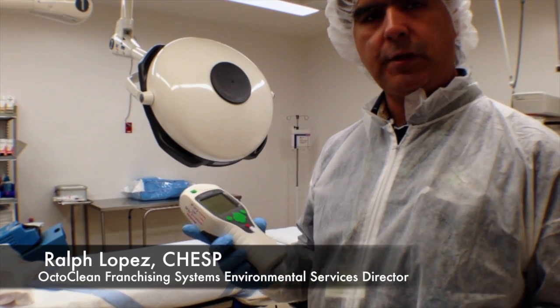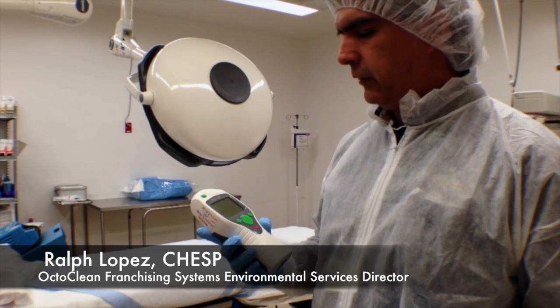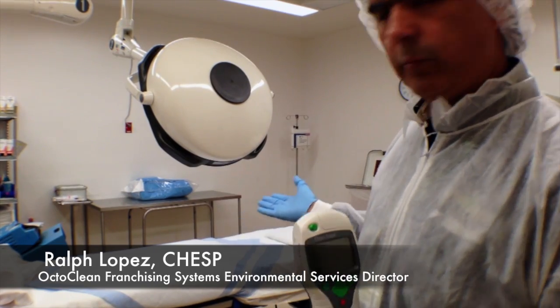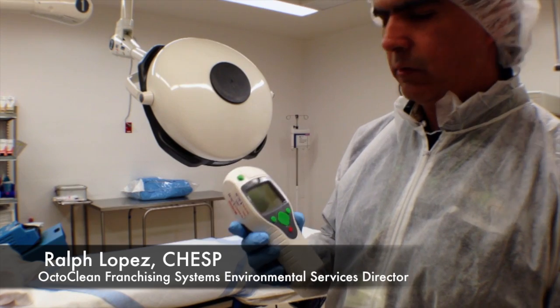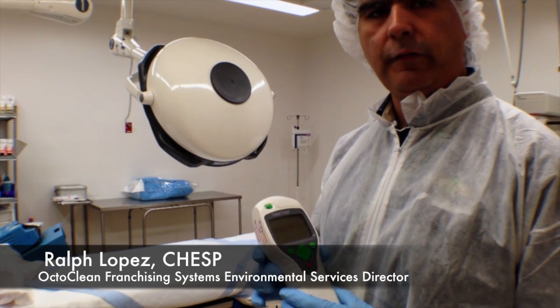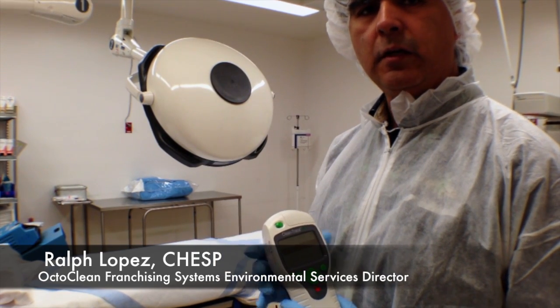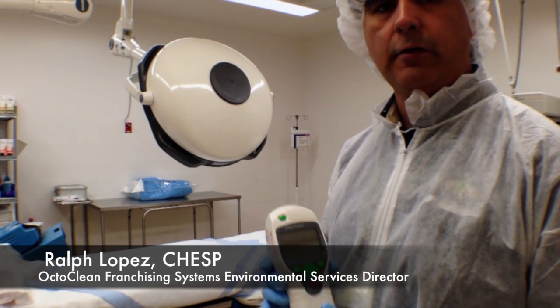I want to stress the importance of having a clean environment available to the medical professionals that use exam rooms such as this for surgical procedures. The CleanTrace is a very valuable unit to Octoclean, and it also ensures to our customers that we are definitely keeping their areas clean and sanitary.